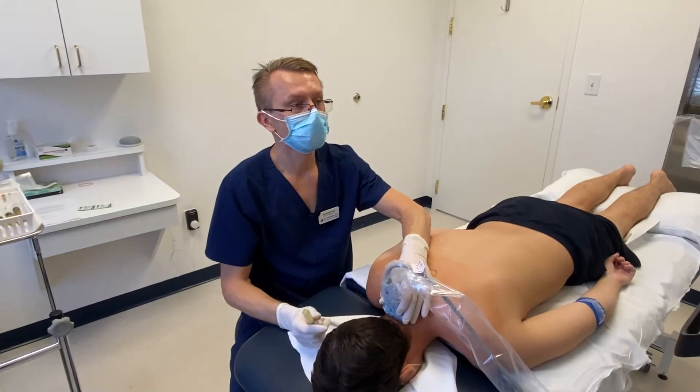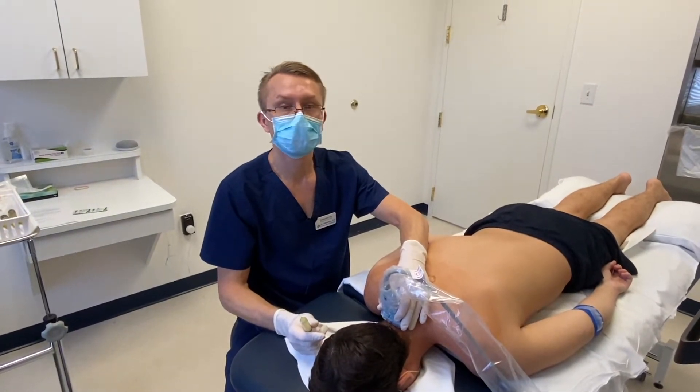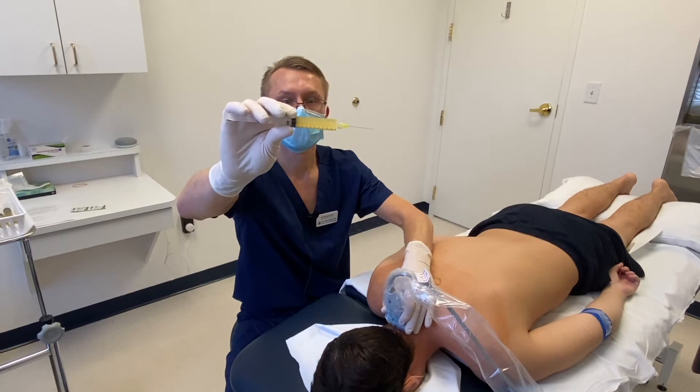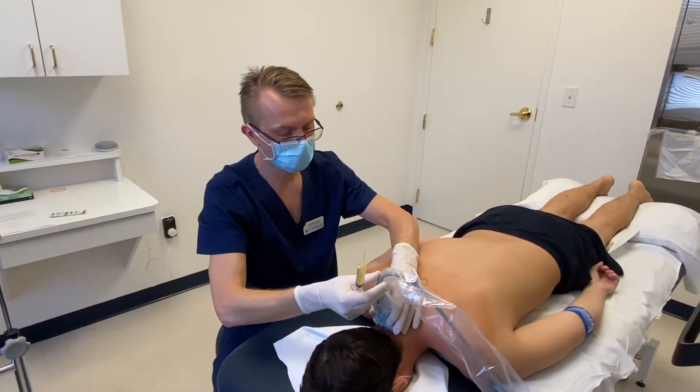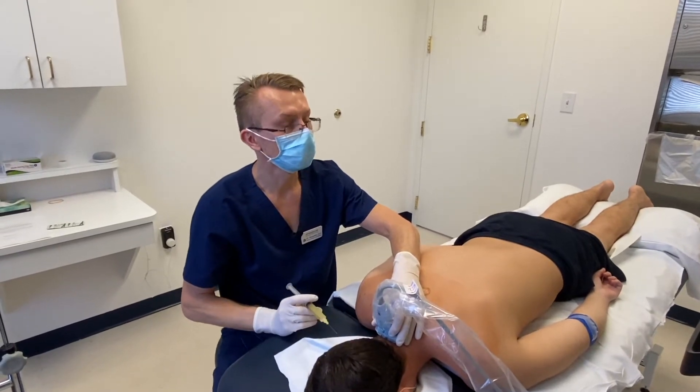Now that his neck area is numb and clean, we're going to go ahead and start with some PRP. Here's the platelet-rich plasma — that's his blood with a little bit of dextrose and some anesthetic. We're going to go ahead and start the injections.